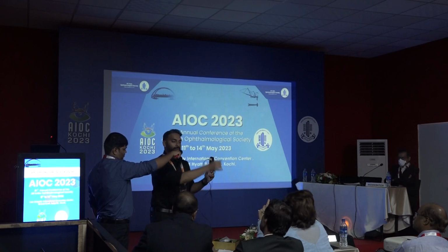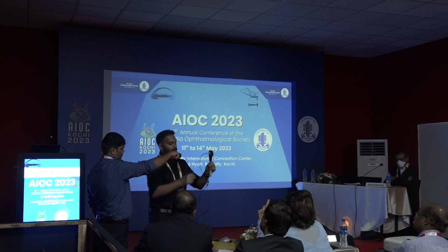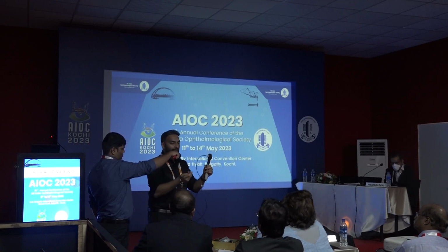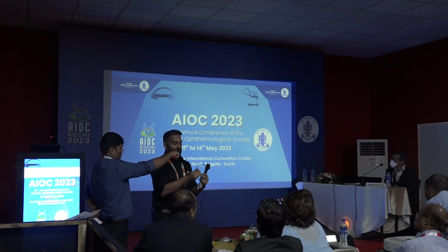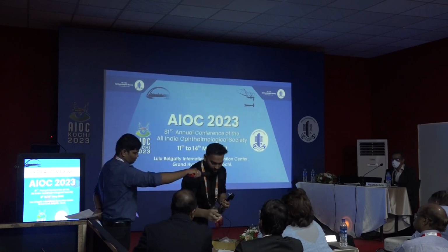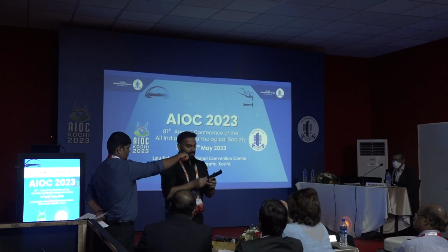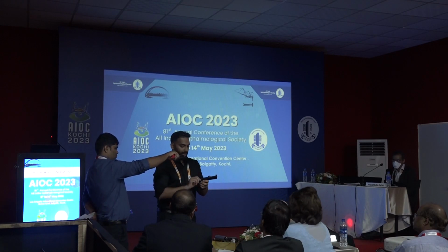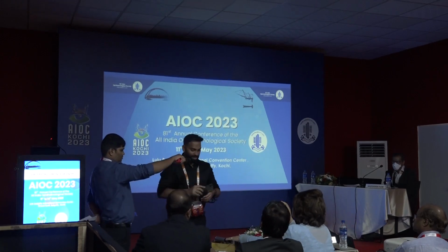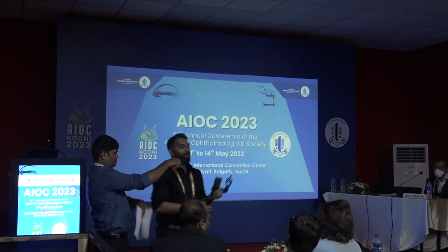You can connect this to your computer, or you can connect it to your phone itself. You have a small adapter which you can connect to the smartphone also. You just have to download an app and it will show up on your phone. This is for the phone, this is for the computer, a USB device, and this is the actual initial prototype. This one directly goes to the smartphone. You just have to open this and connect it to the retinoscope handle over there. This is also very easy. This was the first prototype, and this was the modification.